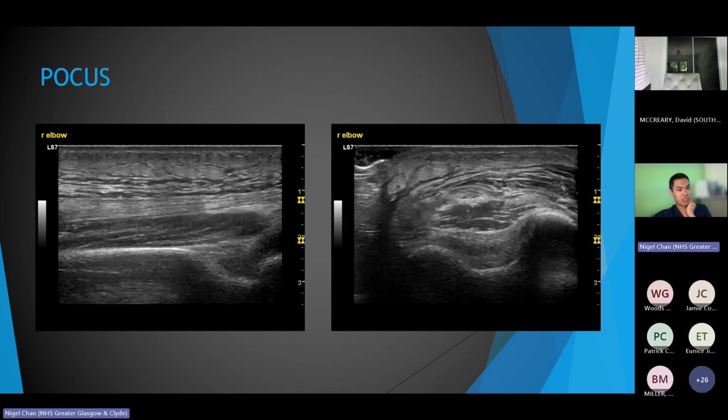But this is basically what cellulitis looks like on ultrasound. It's called cobblestoning, and you're basically just seeing inflamed tissue with inflammatory fluid, which is this black stuff that looks like that. And if it progresses, you'd see an abscess. If it gets really bad, you'd see free air, which hopefully you'll never see, if it becomes necrotizing fasciitis. But I was very confidently able to say he definitely does not have a septic arthritis at that point. I think he actually ended up getting a Doppler ultrasound over the next couple of days, and he had a clot in his basilic vein, probably, which was the cause of his cellulitis.